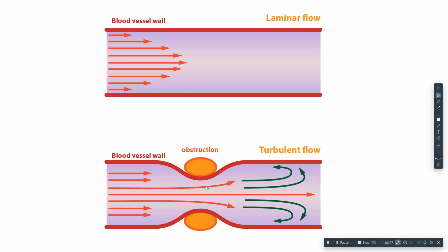When the brachial artery is squeezed, so that's when the cuff pressure is between diastolic and systolic, the blood flow is turbulent, and turbulent flow makes noise. When the blood vessel is not squeezed, it's called laminar flow. It's nice and smooth and you don't hear any sounds.